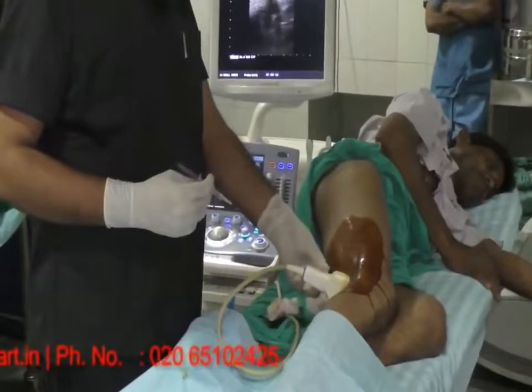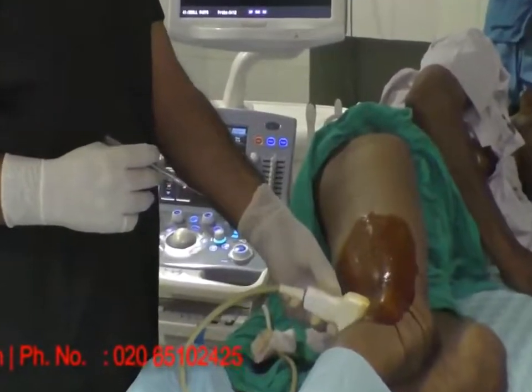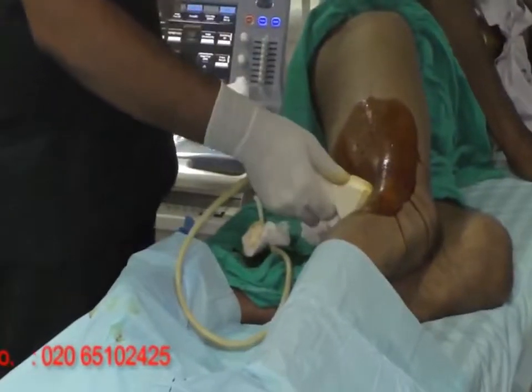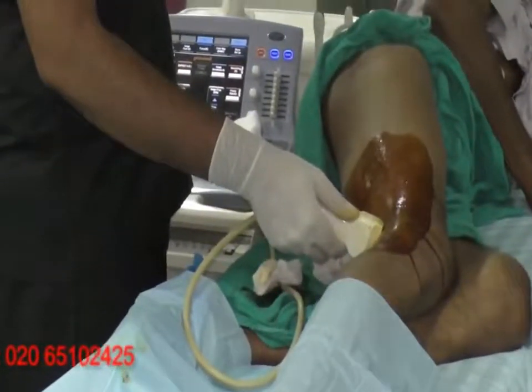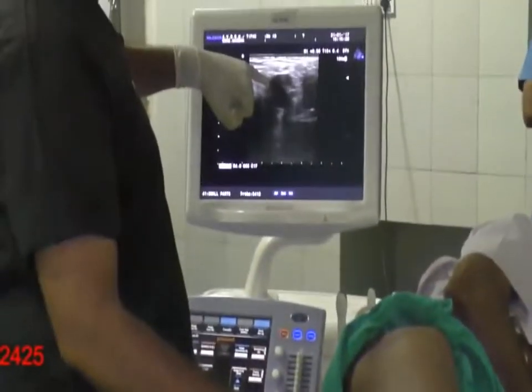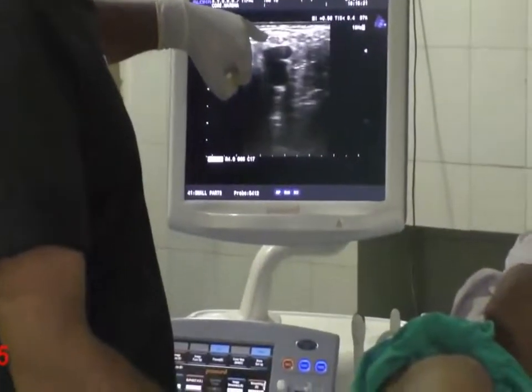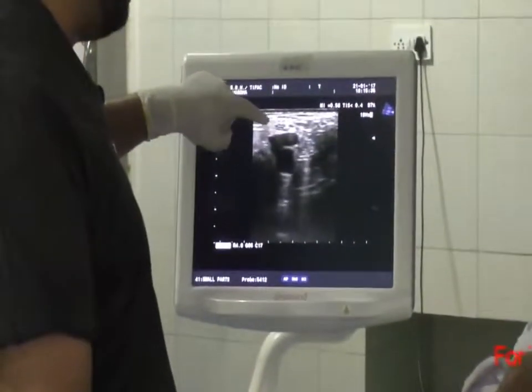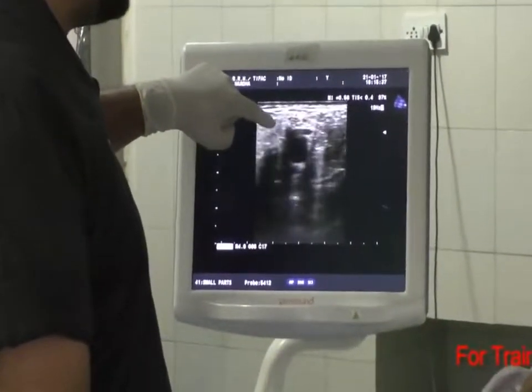If you are looking at this portion, this is the popliteal crease where my probe is right now. On the screen what you can see is: this one is the popliteal vein, this is the popliteal artery, and just superficial to the popliteal vein you can see this grape-like structure — it is a beehive-like structure, which is the tibial nerve.